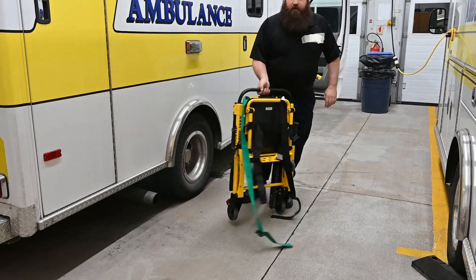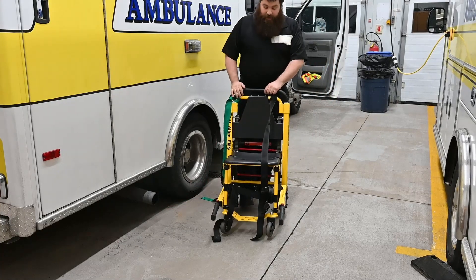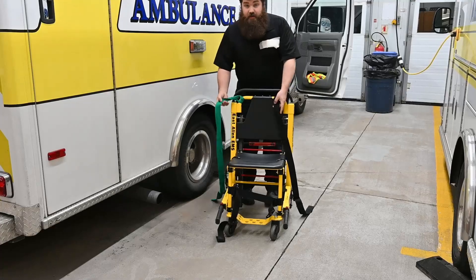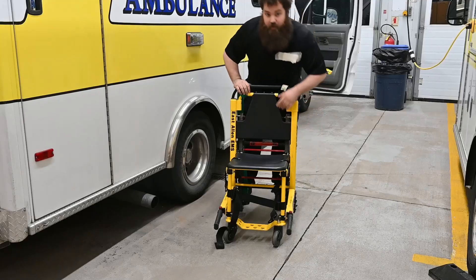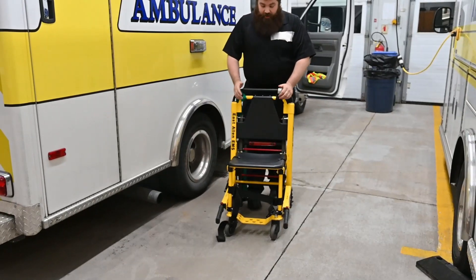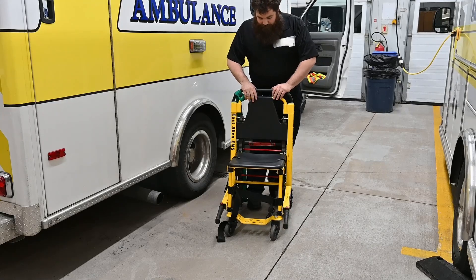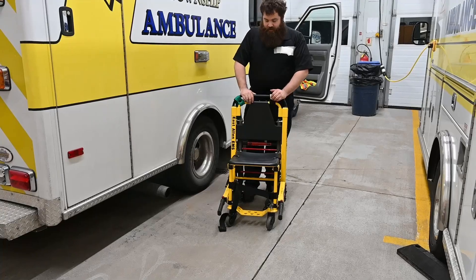First and foremost, very easy, very simple — it just pops open and locks. Once it's open in this position, I like to make sure all the straps are out of the way before any movement with your patient. In a normal scenario I would have a blanket down and then wrap that blanket around the patient, but for this demonstration we're going to skip the blanket.